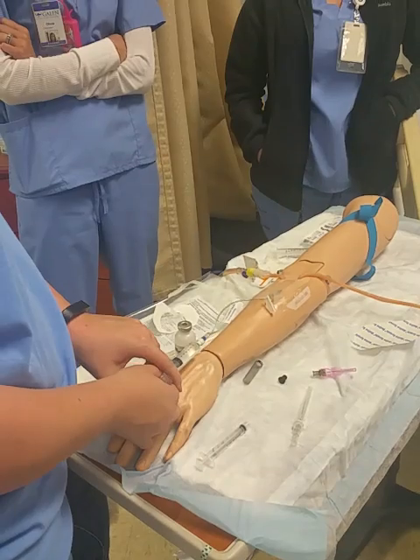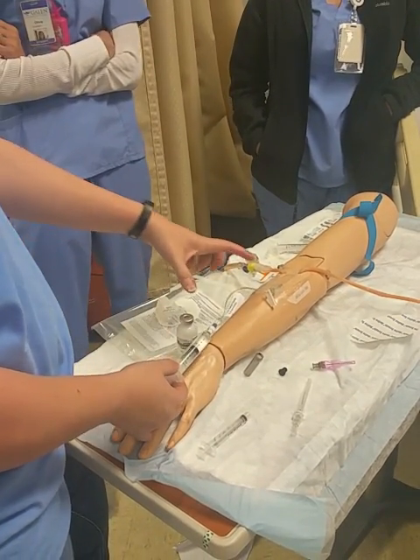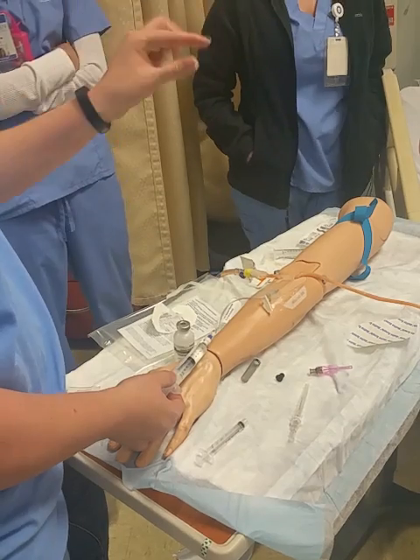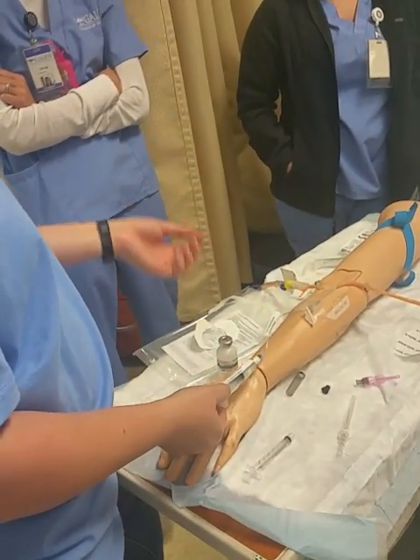Go the same rate. Yeah, this doesn't even hold 1/4 of an ml. So usually it's hard to even tell that nurses do it because they just push a teeny tiny bit and then they push the rest of it. Because once it's in the bloodstream, it's diluted.